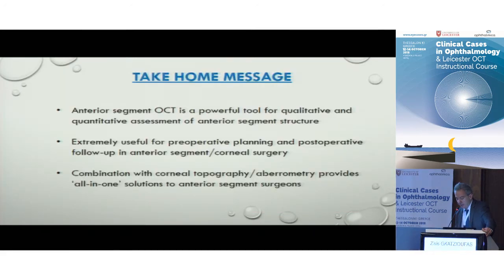So I will summarize the talk in the form of a take-home message. Anterior segment OCT is a powerful tool for qualitative and quantitative assessment of the anterior segment, very useful for all anterior segment surgeons, corneal and refractive surgeons. It's extremely important for the planning of the refractive procedure, also for the follow-up of the patient and assessment of potential complications.